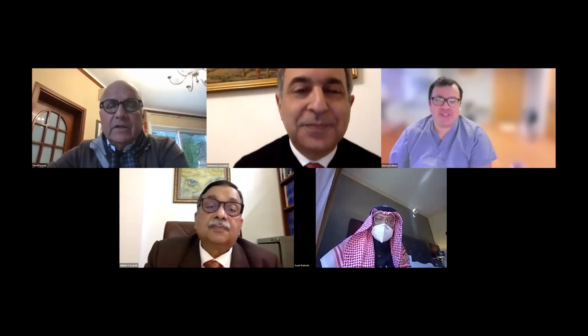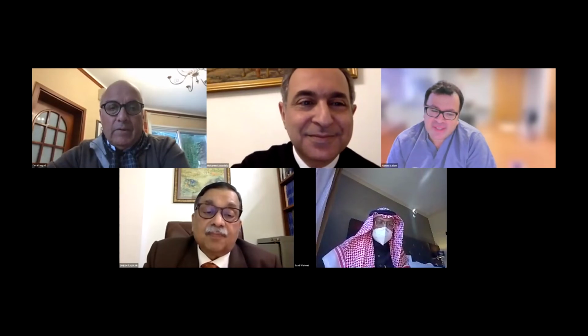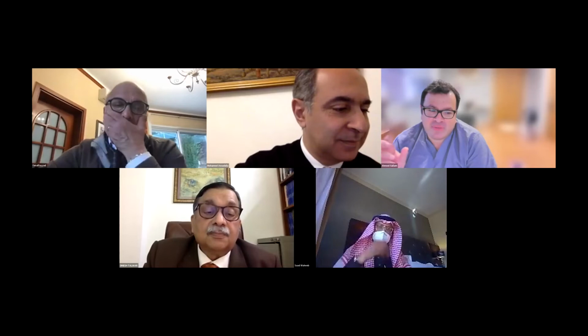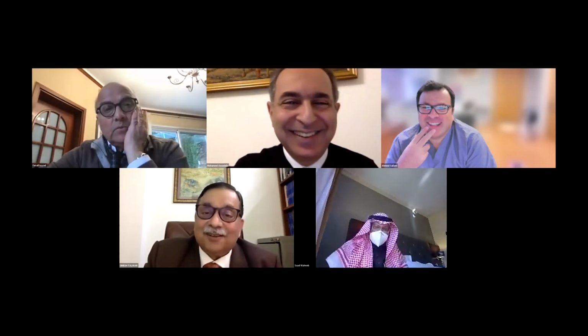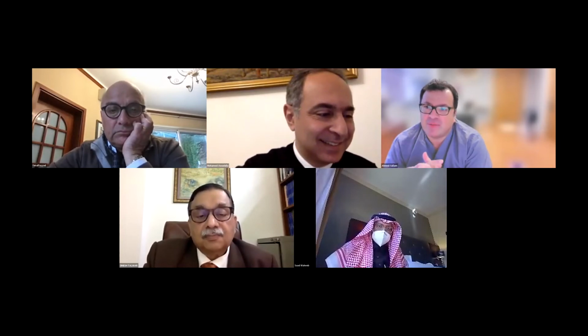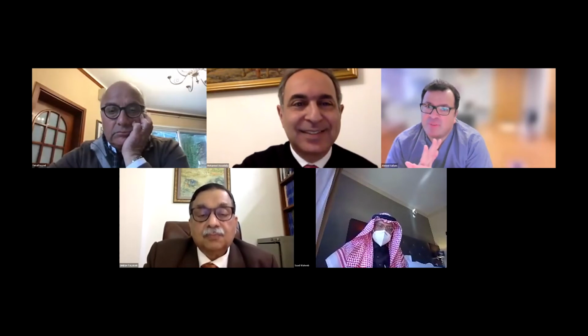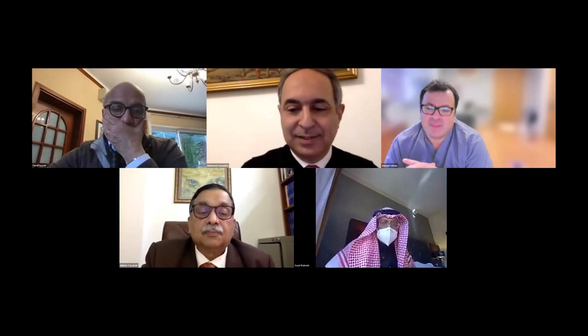Really, where is Dr. Salam? Do you have a comment? Yes, thank you so much. I enjoyed Dr. Saad and Dr. Faisal's presentation so much. I just want to say, I think this comes from the car industry. If you use the 20,000 oil, you feel you can leave it longer, right? But actually the truth is, the differences between 1000 and 5000 are more on the theoretical level, because the main factors governing emulsification are the movements of the eye and intraocular inflammation. Then the 1000 versus 5000 centistokes doesn't make a lot of difference, in my opinion. So I always like to keep things simple, and I use 1000.